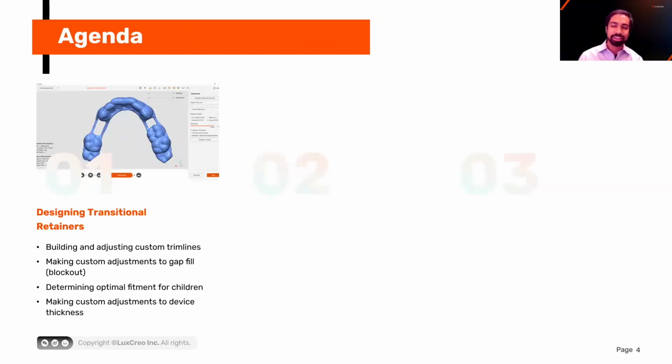Thank you so much for the generous introduction, Greg. It's more than I deserve. And thank you so much for joining this webinar. I think it's going to be a great experience. Like Greg said, we are going to move a bit quickly. We have a lot of technical ground to cover, a lot of exciting features that can really enable your practice, your creativity, and what you're able to do.